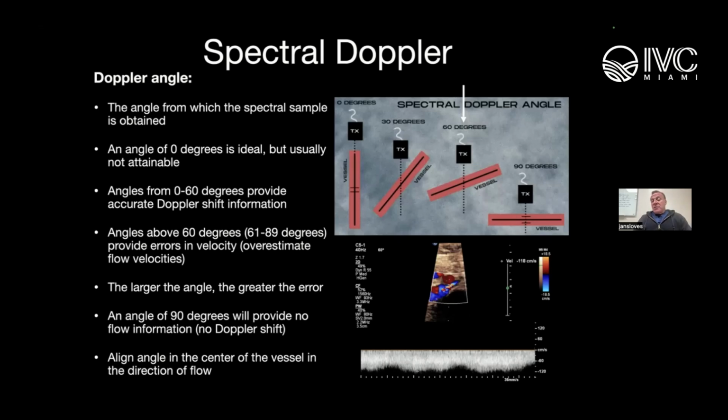You were just talking about the color bar, reds towards, blues away. You can see that the insonation of this vessel is color coded in blue, and the overlying vessel is color coded in red. What I also want to point out is that we talked about the higher hues of the velocity on the color bar, and we can see that we have the color scale at 18. But because there's such a tight stenosis there, the velocity is high, and that's why you're seeing the aliasing effect within that vessel, because that vessel is basically pancaked in there.